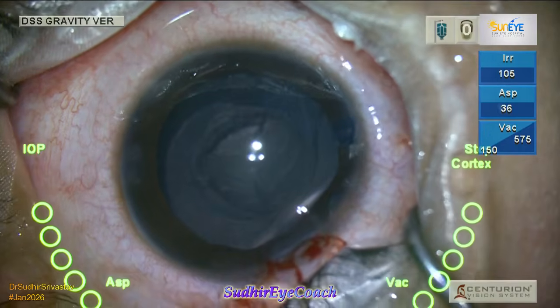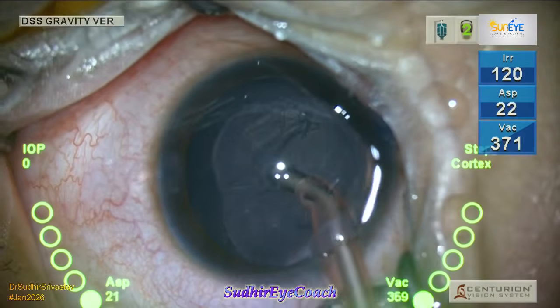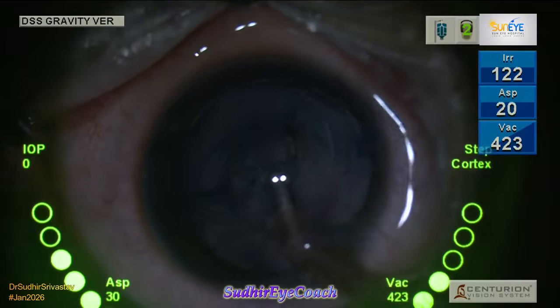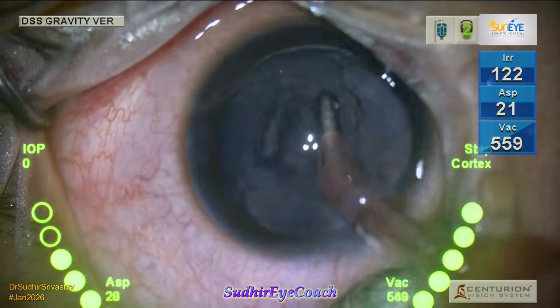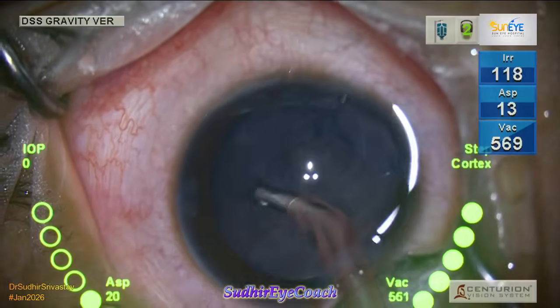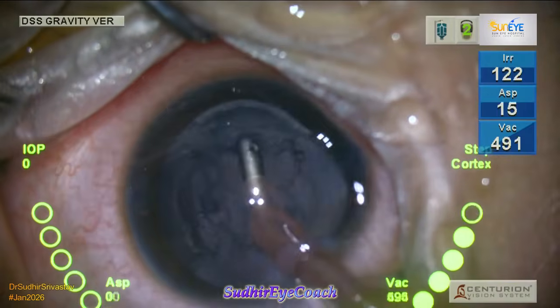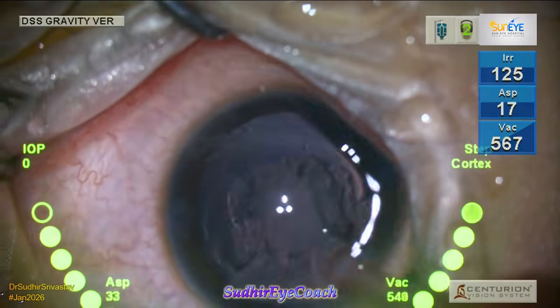Even though the red reflex was reasonably good, staining of the capsule should not be skipped in pediatric cases as it provides better control and reduces the risk of an uncontrolled peripheral extension. The rest of the phaco procedure is relatively straightforward because there is no formed nucleus. Therefore, I directly proceeded with irrigation and aspiration, and gentle hydroprocedures were performed to separate and loosen the cortical matter within the capsular bag, which significantly facilitates easy and safe cortical aspiration.